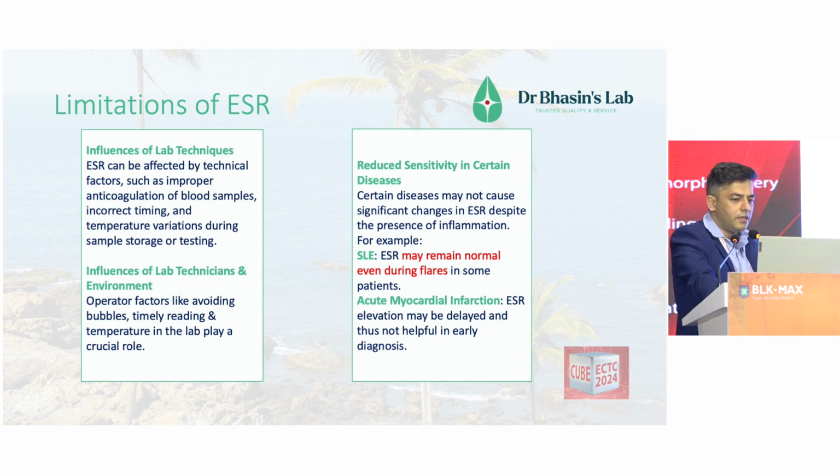So these were the technical limitations, but the practical ones are that it's a subjective assay. The test is completely manual. It is operator dependent and environment dependent. No matter how simple it may look, we are completely reliant on technicians to fill the tubes properly and read at exactly 1 hour. And it's become more challenging now, because with everybody having a mobile, half the time the technician on duty is waiting while he's put the timer. Earlier he used to use the timer in the lab, now he uses his mobile and is seeing reels. So whether he's reading at 1 hour plus or minus 1 minute, there's really no way we are able to assure that.